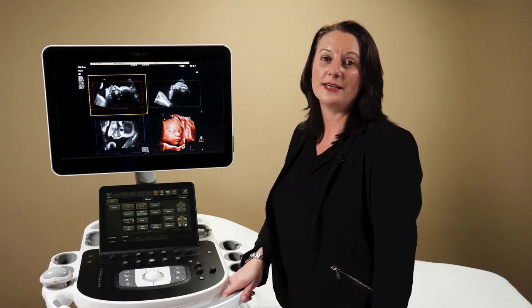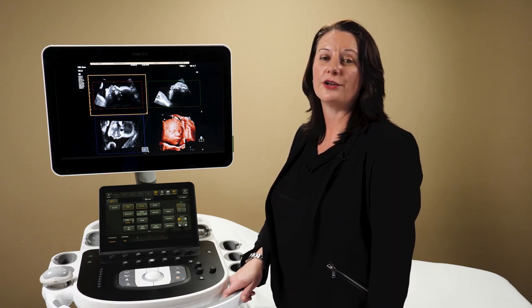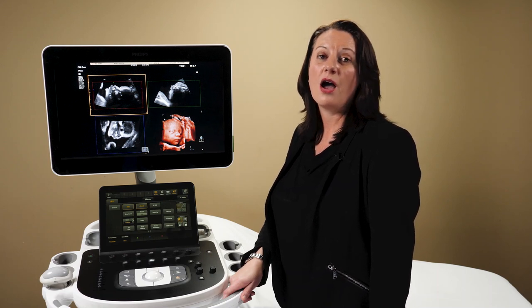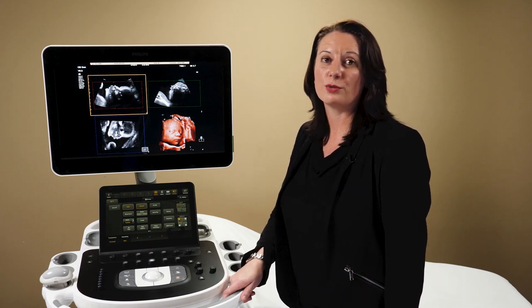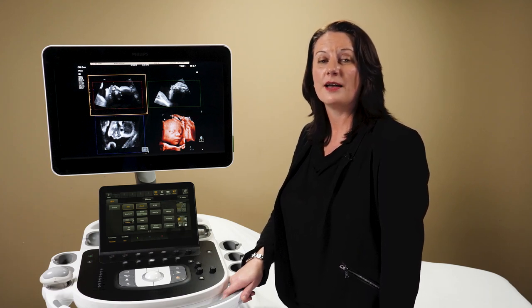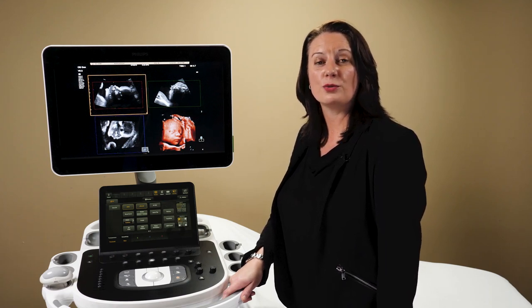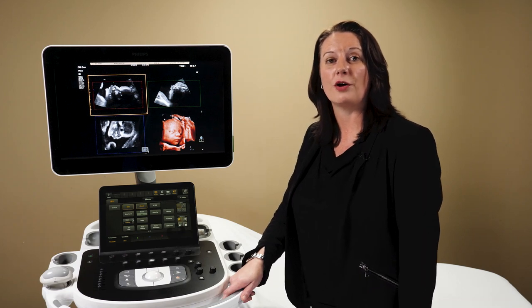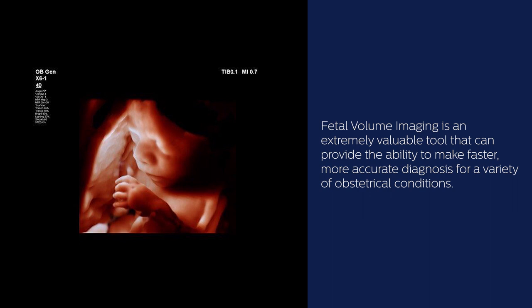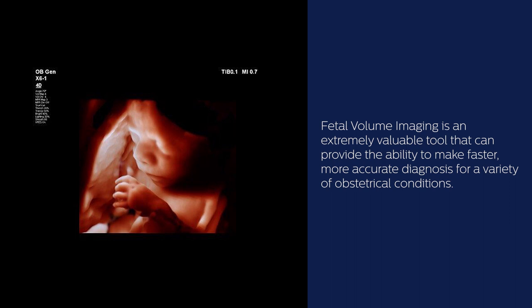In this video, you will see a demonstration on how to acquire a 3D or 4D obstetric data set. After the video, you will be able to acquire and manipulate the volume data set of a fetal face. These steps can also be used to acquire and manipulate the volume of any other fetal anatomy. Fetal volume imaging is an extremely valuable tool that can provide the ability to make faster, more accurate diagnosis for a variety of obstetrical conditions.